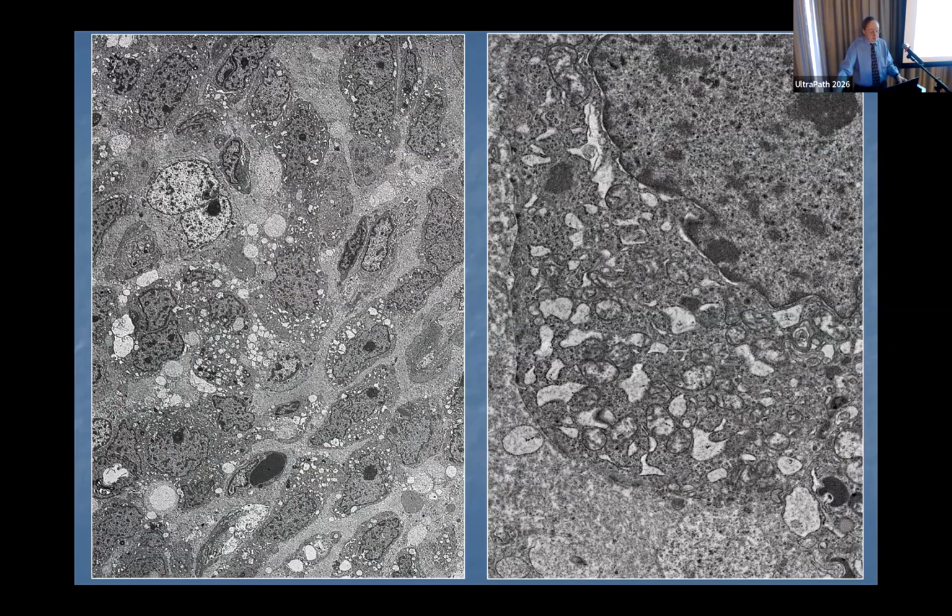Looking at this, these are very undifferentiated neoplasms. You see that the endoplasmic reticulum is widened in these areas. You really don't see any pre-collagen or pro-collagen within these, and in the background you don't see that the cells are secreting any type of collagen. So fibrosarcoma is not a consideration. There's nothing in here that looks histiocytic in origin either.